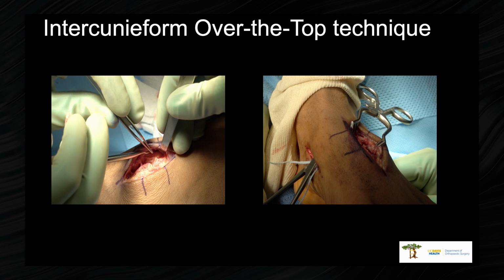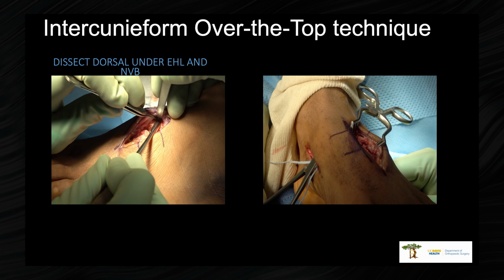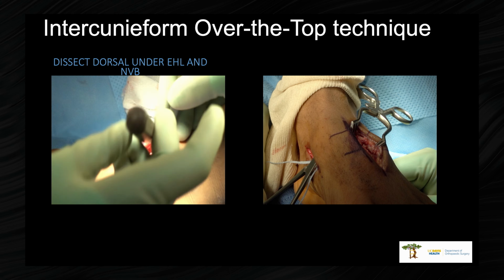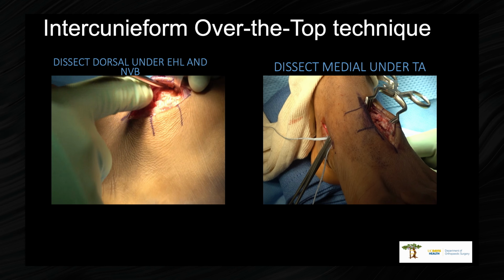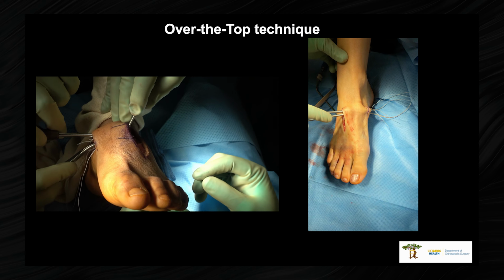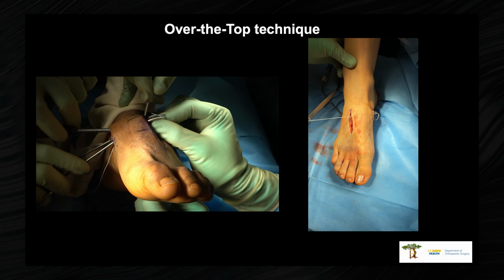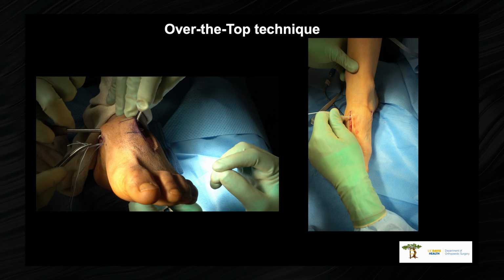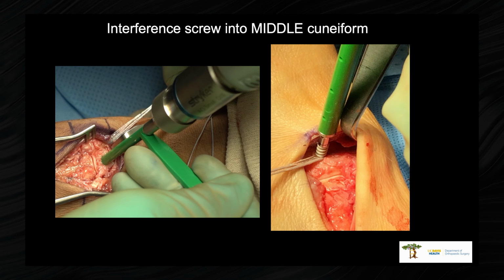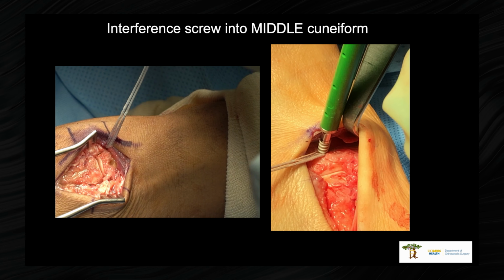And then now we bring it over the top. So you have to extend your medial incision a little bit, but use common sense. You got to make sure you get underneath the tibialis anterior and underneath the neurovascular bundle. And then you just pull it through. And then you drill, and with maximal tension, you put the InternalBrace up and over the top.